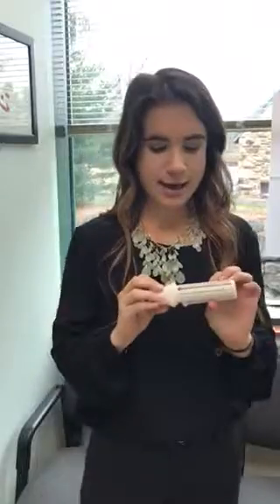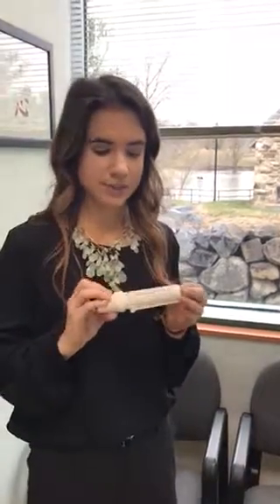I will show you. You ideally want to breathe into it 3 times and get the highest level, but the idea is to breathe in it daily so that way you know what your average is when you're feeling healthy and normal, so that way when you're having symptoms of shortness of breath or tired, you can breathe into it and see how different you are from your average, so that way we can better help adapt your management plan and treat you. So I'm going to show you how to use it.